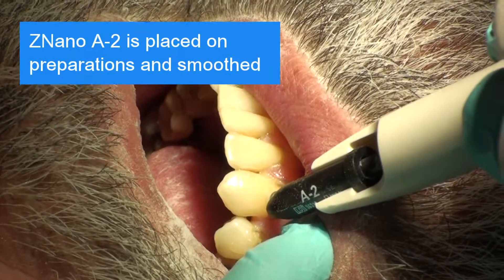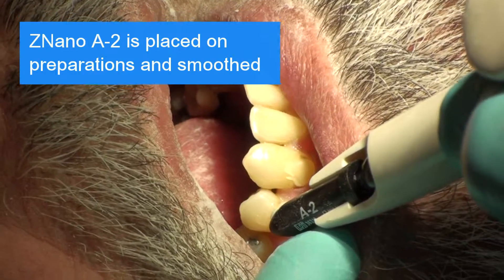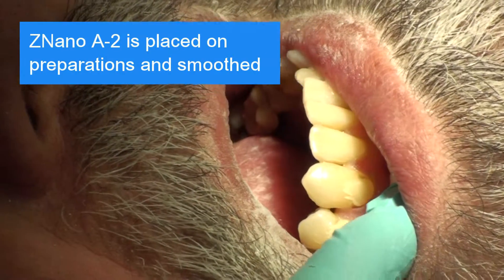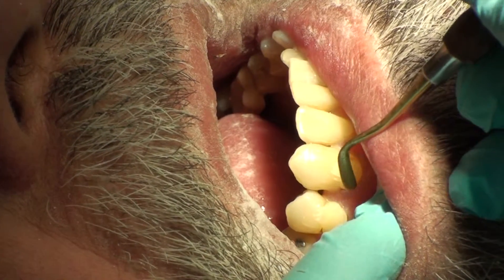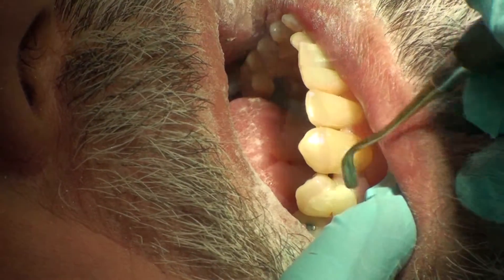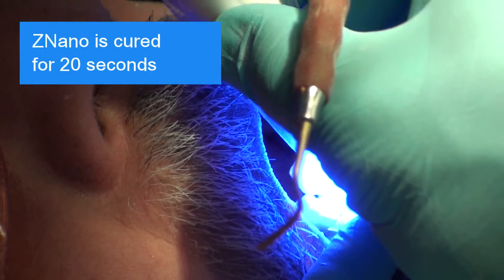Znano Universal Composite, shade A2, is placed on the preparations and smoothed. The Znano is cured for 20 seconds.